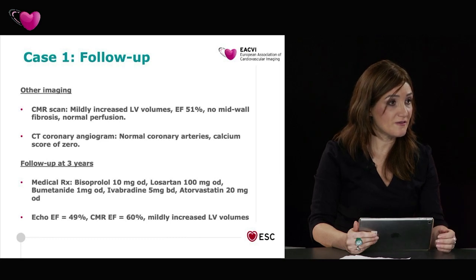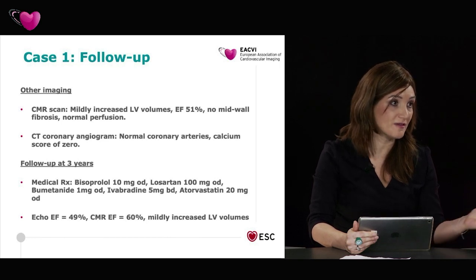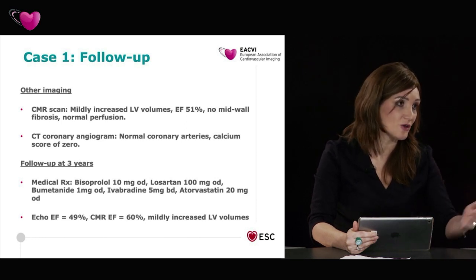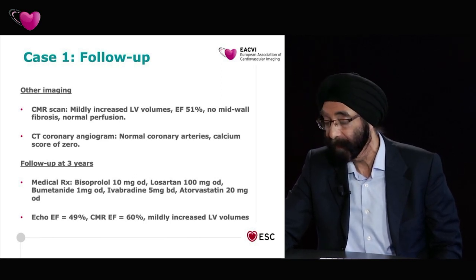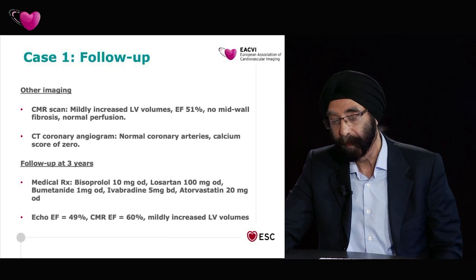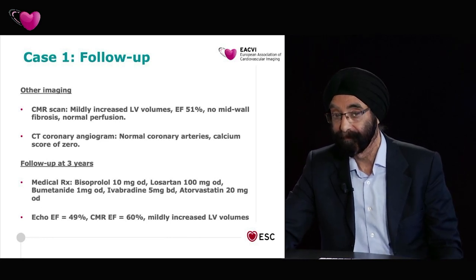Can we say, Raj, that the fact that the patient had normal perfusion was a positive factor in the sense that they have low event rate usually, so what is the prognostic value of a normal? Well, yes, I think in the context of coronary artery disease, as with SPECT imaging, a normal SPECT perfusion scan indicates a very low risk of a coronary event. Normal motion indicates a good outcome. So this patient really is more driven, the prognosis is more driven by the left ventricular dysfunction and the other pathology. The fact that perfusion is normal is obviously a bonus for the patient.